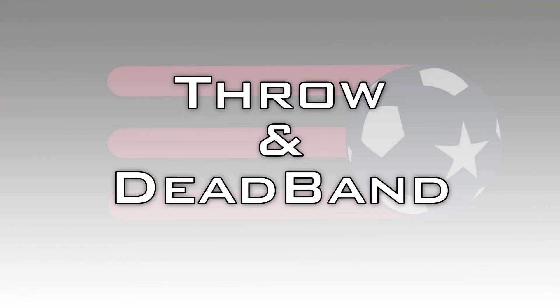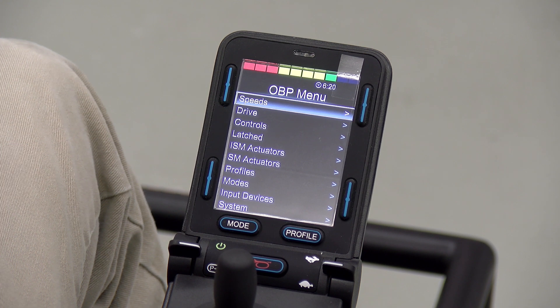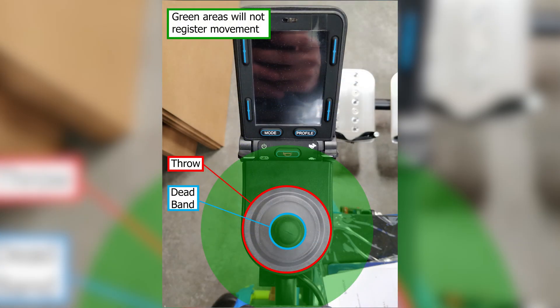The last thing we're going to go over is throw and deadband. Both of these settings are kind of personal preference, so I'm going to show you where they are, what they do, and how to adjust them. Starting with throw — you can see the red ring in the graphic. If you turn down the throw setting, that ring will contract. So if you're not able to push the joystick all the way forward, you can turn down the forward throw so that pushing it halfway would still register as 100%. Deadband is very similar to throw but starts from the inside out rather than the outside in. The more you turn up the deadband, the more that blue ring will expand in the center.